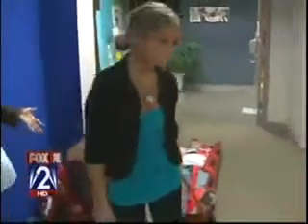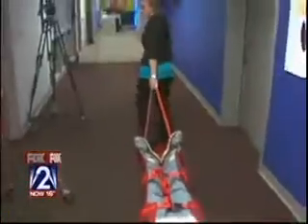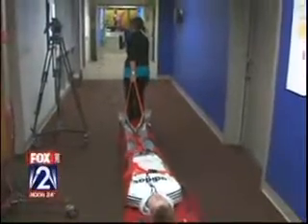And so is that the idea, to have a person of smaller stature be able to do exactly what she's doing? Yes. We're in a situation where we have to get people who are permanently disabled or potentially a basketball star like Nick who maybe broke his ankle or pulled an ACL and can't walk out himself. How do you get someone out of a building like that in our schools?